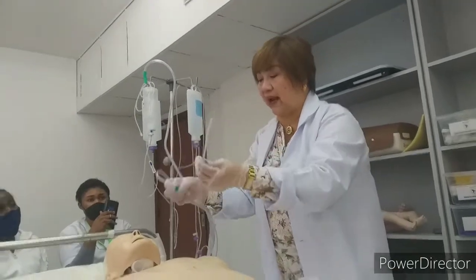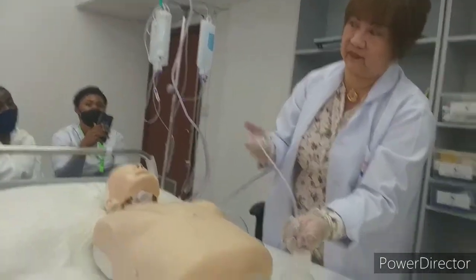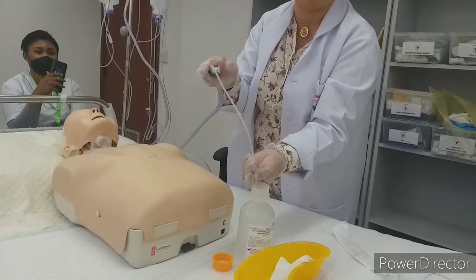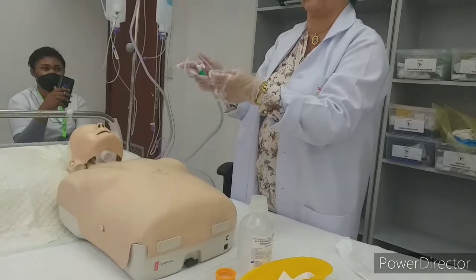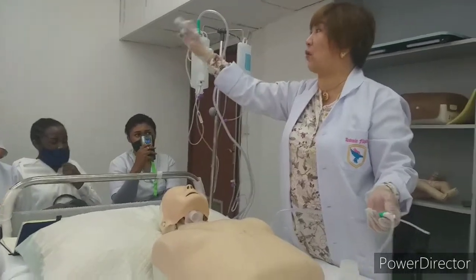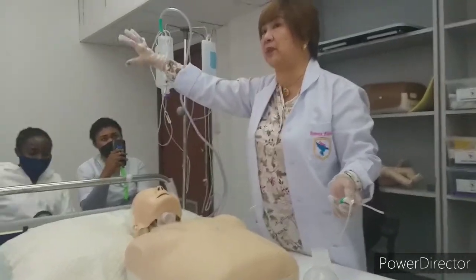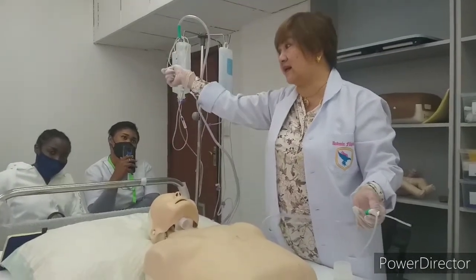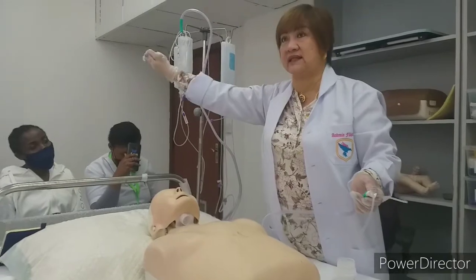Okay? What we need to do now, as we open, dip. Okay, I did not put my finger. Dip, close. Suck out, suck out. This is how we test whether our machine is working well. Now, sorry, we need to set it to 1 on that gauge, 1, 2, 3, 4, 5. The minimum is 1, so set it to 1. The pressure of the gauge is set to 1. When you put it to 3, 4, 5, it will be higher. So set to 1 or 2, but set to 1.